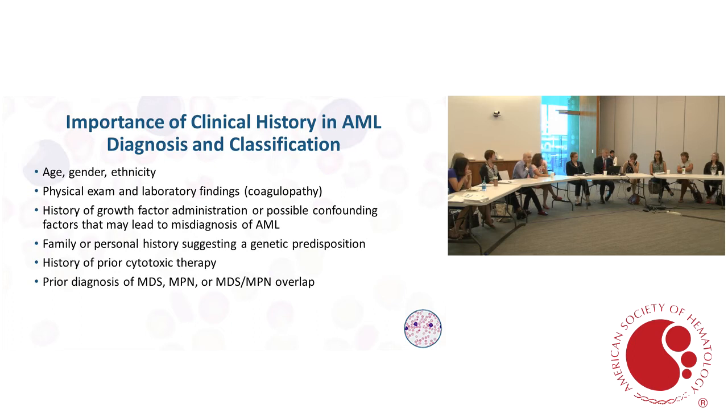It seems like it might not be, although it technically still qualifies. I just want to say, I was talking to someone earlier, at the break, that I've seen severe dysplasia in NPM1 mutated AML. So you have to be a little careful. In fact, once I called it AML-MRC, I said this has to be AML-MRC, and then it came back with an NPM1 mutation, so I had to revise the report. So I think again, this is getting superseded more and more by cytogenetics and molecular findings.